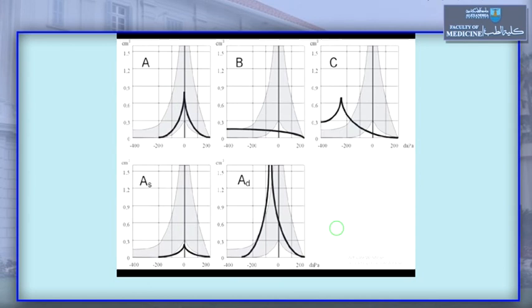Now, you have to know that this condition is associated with hearing loss because the ossicles are fractured, so sound cannot be transmitted efficiently to the inner ear. The patient has conductive hearing loss, but the compliance is increased. So increased compliance doesn't mean better hearing. Increased compliance means that the system has no resistance. And since resistance is very low, compliance is very high.